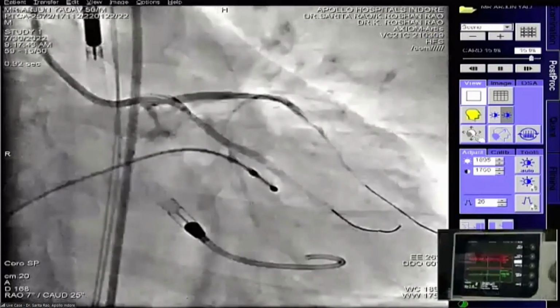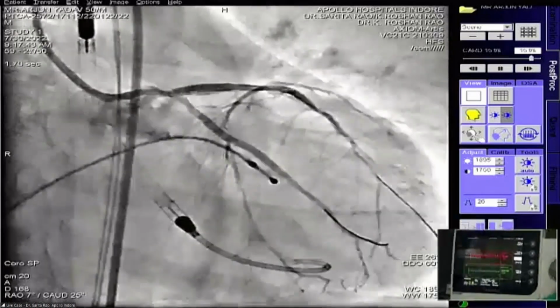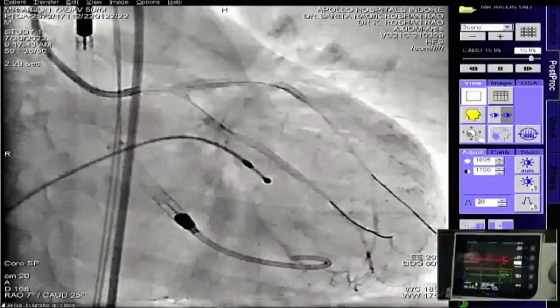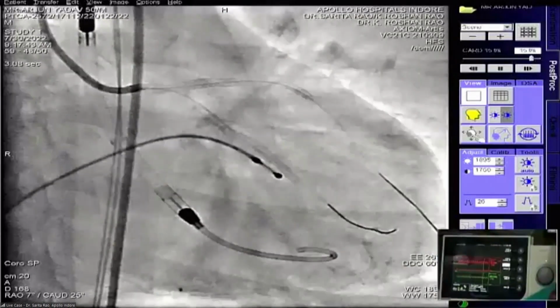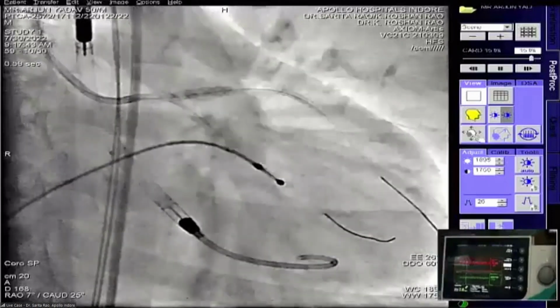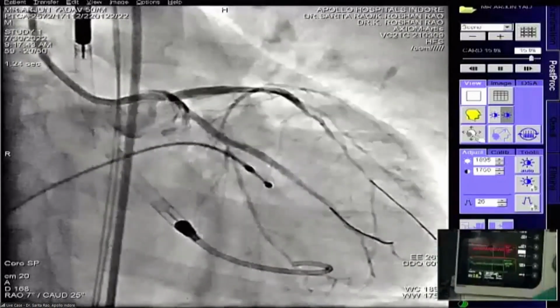Madam, what I suggest is, because we overlap in the two centers, probably you'll do POT and optimize the result there. We'll go briefly to the other center, and after 20 minutes we'll come back to you so that we can see the rest of the work. Is it okay? Sure, definitely, Dr. Srinivas. Thank you so much. Okay, madam, we'll come back to you in 20 minutes. Thank you. Anil, you connect that.